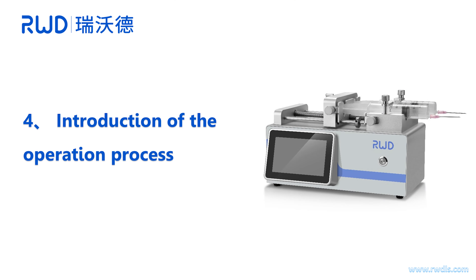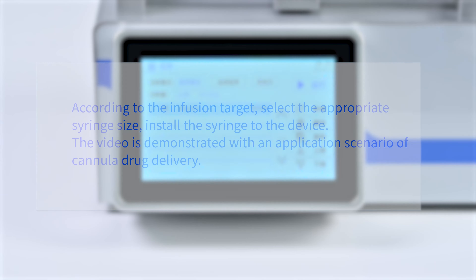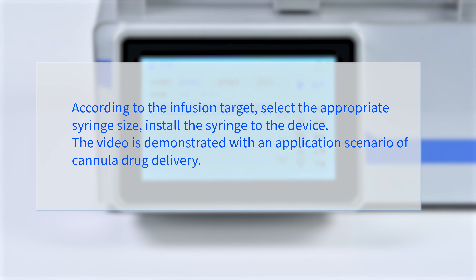Introduction of the operation process. According to the infusion target, select the appropriate syringe size and install the syringe to the device. The video is demonstrated with an application scenario of cannula drug delivery.